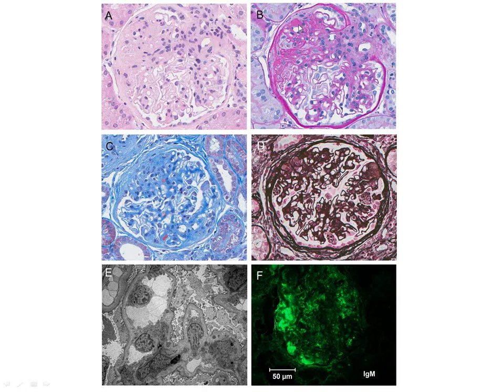You also get a hint down in the JMS in the same region where there's that sort of globular area of faint as opposed to dark. So yeah, right here the GBM is taking up a lot of silver, and this area isn't taking up silver. So that helps.